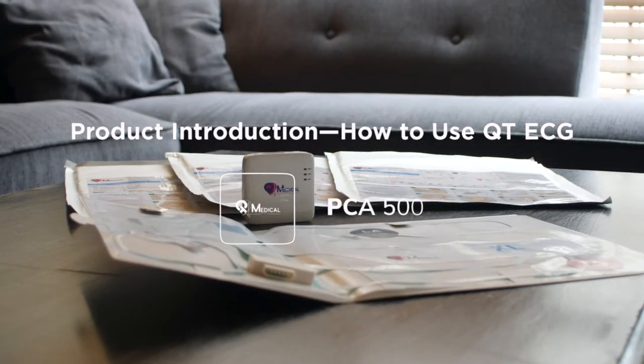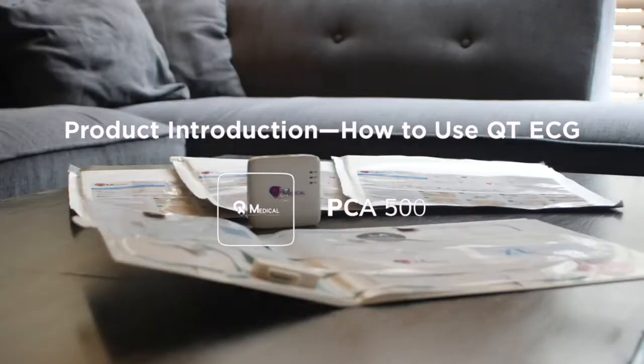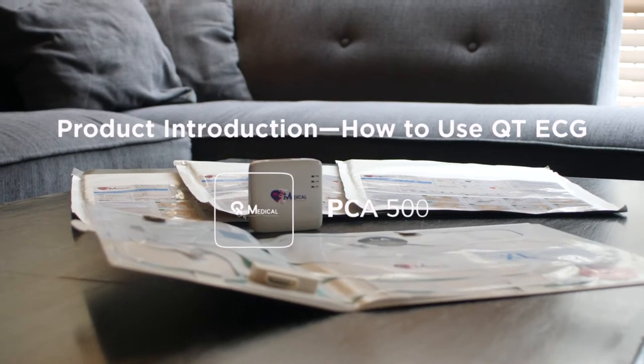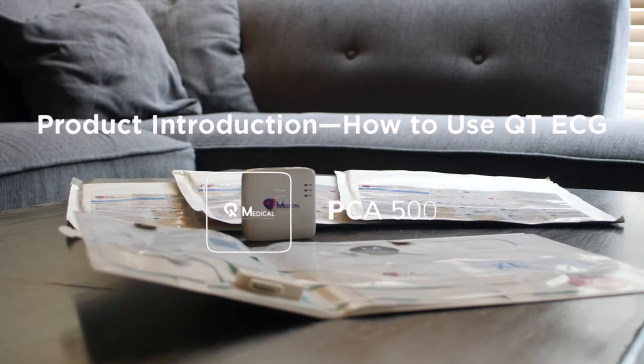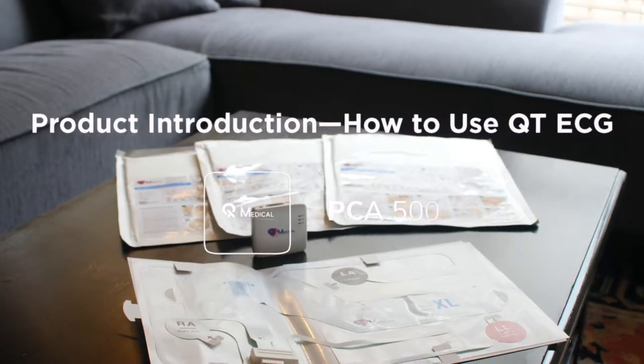QT-ECG is a revolutionary electrocardiogram for patients to use at home so they can better take care of their heart health. This video demonstrates how simple it is for patients to complete a high-quality 12-lead ECG using QT-ECG.